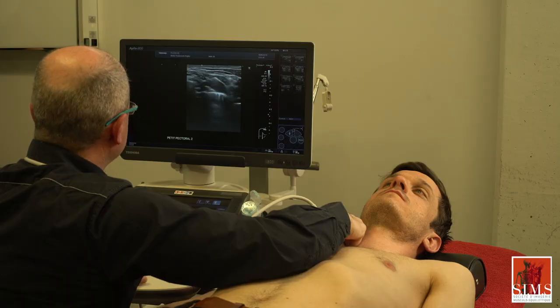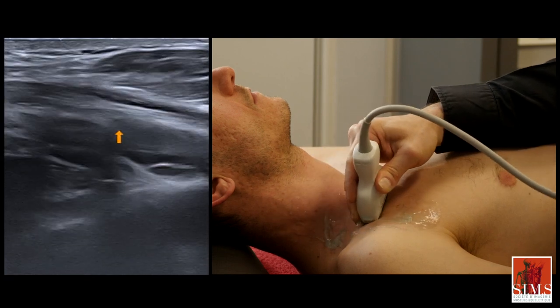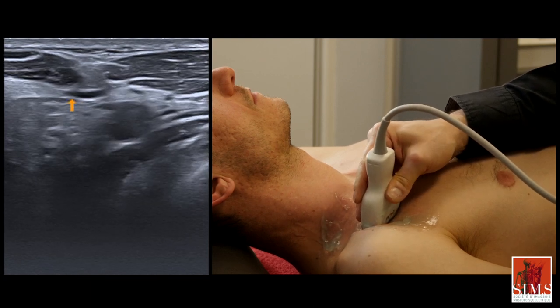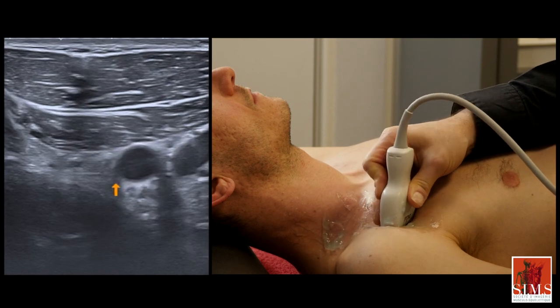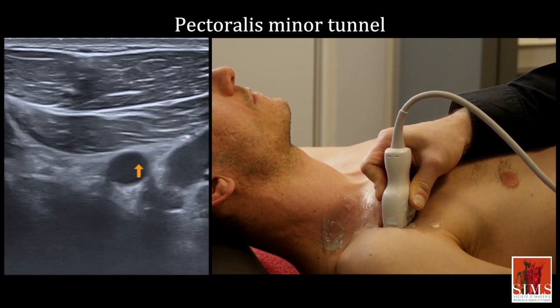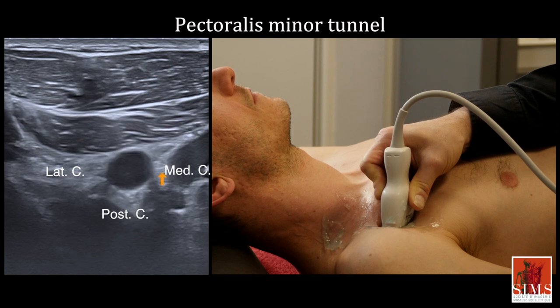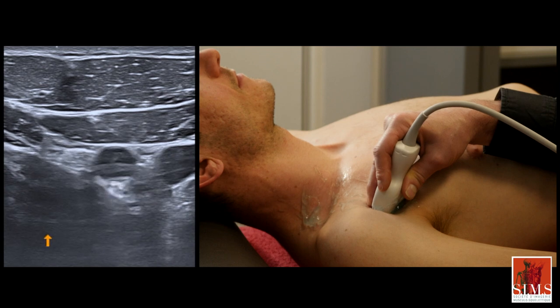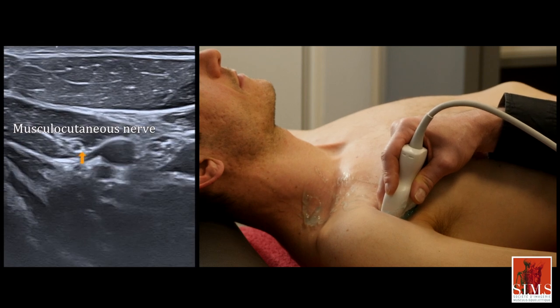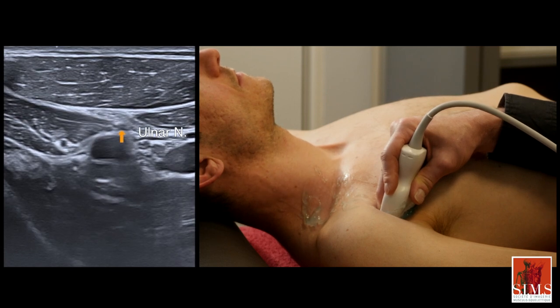We will now go on to the infraclavicular region. Here we follow our subclavian artery as it passes under the clavicle; an acoustic shadow prevents us from following it. We continue distally from the costoclavicular space, where the subclavian artery becomes the axillary artery. Descending further, we come to the area of the pectoralis minor tunnel, with the pectoralis major, the pectoralis minor, and the axillary artery. The cords are arranged according to their names: the lateral cord is lateral, the posterior cord is posterior, and the medial cord is medial. Below the pectoralis minor tunnel, the cords reorganize to give off terminal nerves. Notice the musculocutaneous nerve, which penetrates the coracobrachial muscle anterior to the axillary artery, the median nerve, the ulnar nerve which is medial, and the radial nerve the most posterior.